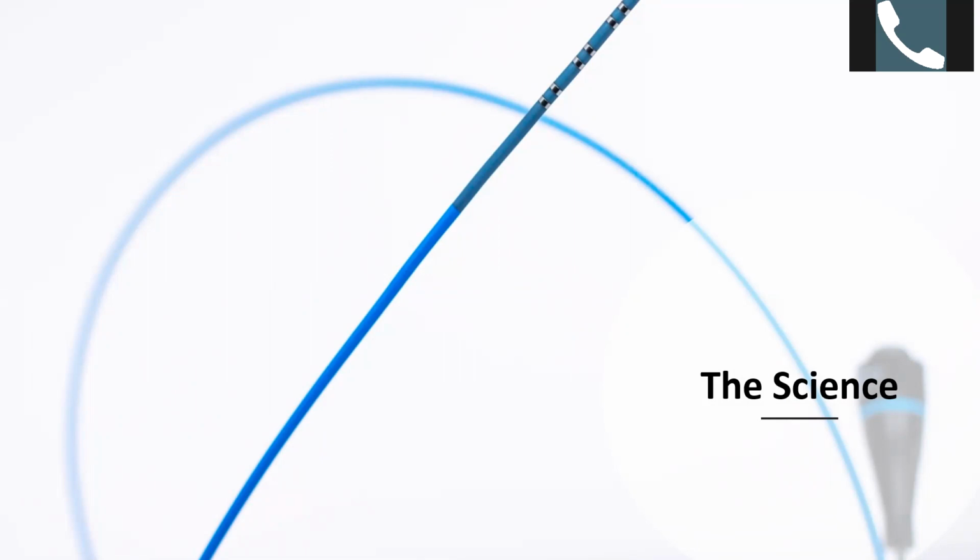But really getting down into the lumen into such a small space and still being able to show the endpoints for cleaning down to the microgram per square centimeter proved to be challenging. So there was an evolution of the process. There was a lot of back and forth between FDA on the method, and ultimately we were able to find a solution. So again, what we're looking for is to really have everybody understand, and all questions are welcome, to know how these lumens are cleaned and what we have to do to clean them.